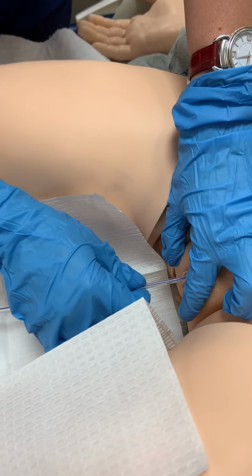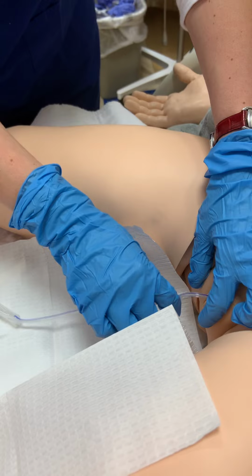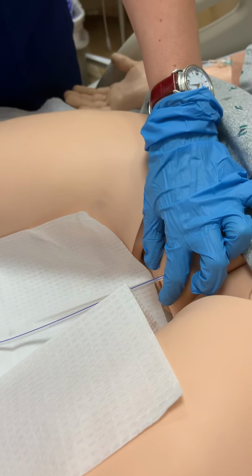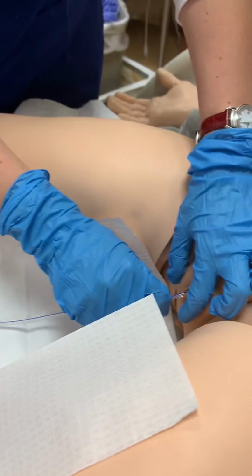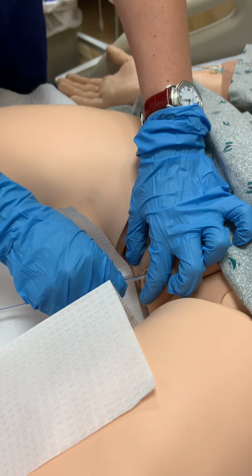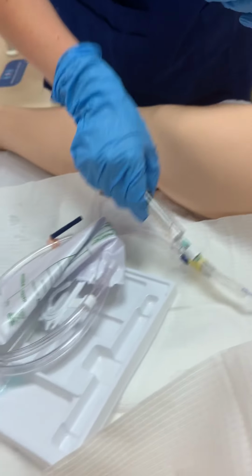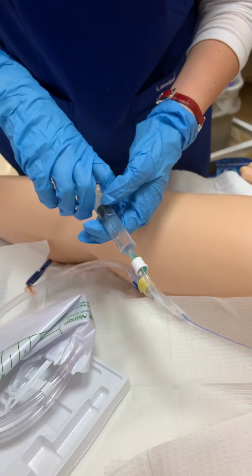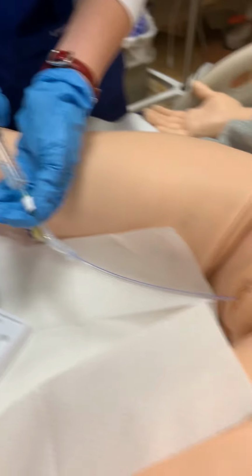Believe it's gone in far enough. I can see the urine. Great. So at this point, I am going to push it just another inch or two since I saw the urine. So it should be in there far enough. And I'm going to push in the 10 mLs to inflate the balloon.